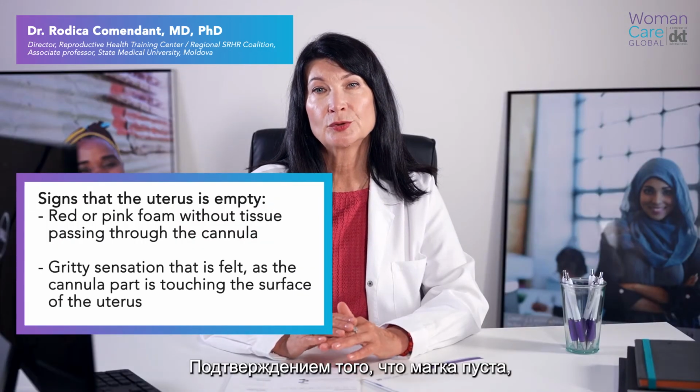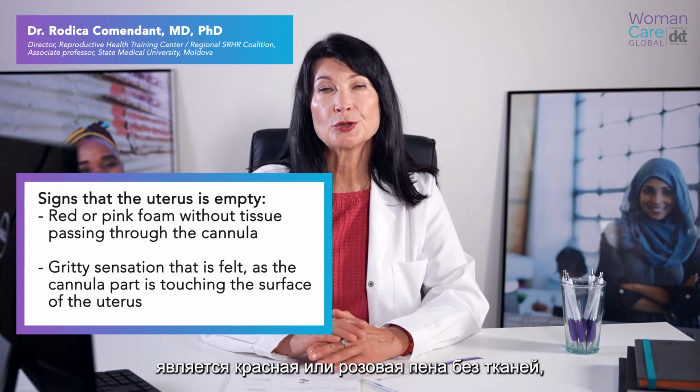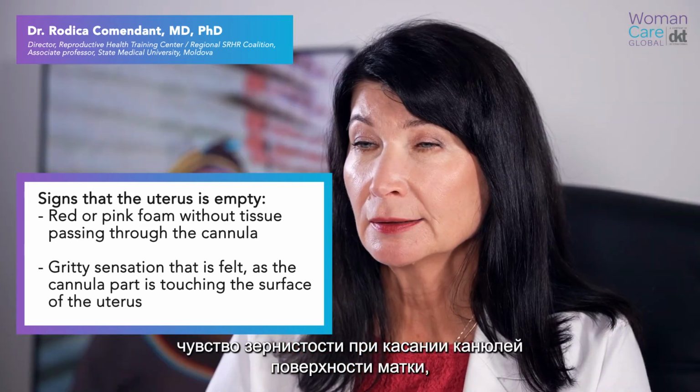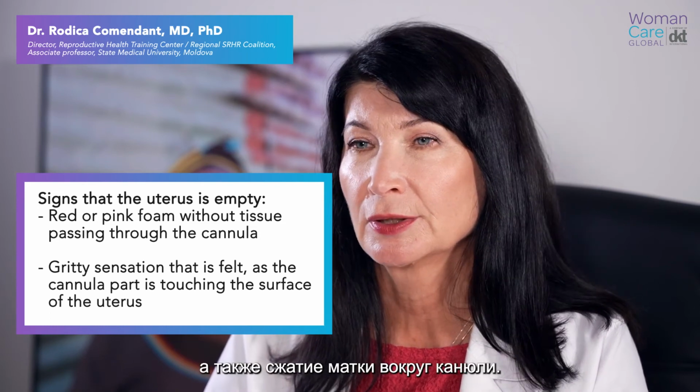The signs that the uterus is empty include a red or pink foam without tissue that is seen passing through the cannula, and a gritty sensation that is felt as the cannula is touching the surfaces of the uterus, and the uterus contracts around the cannula.